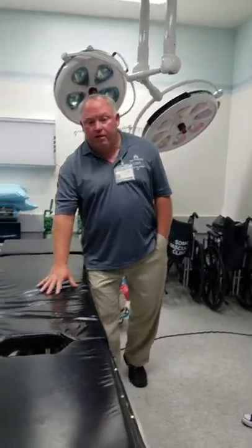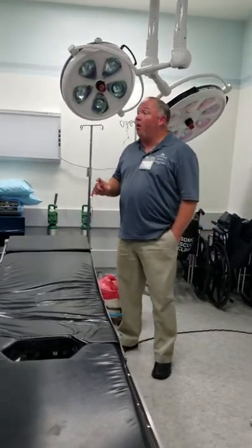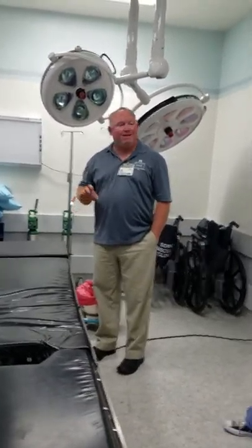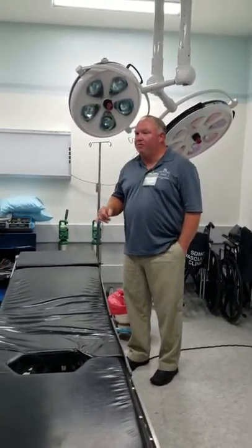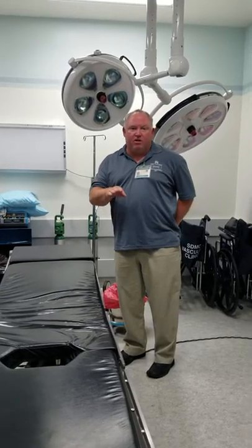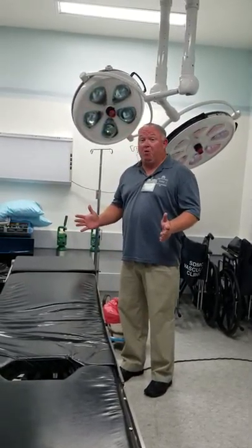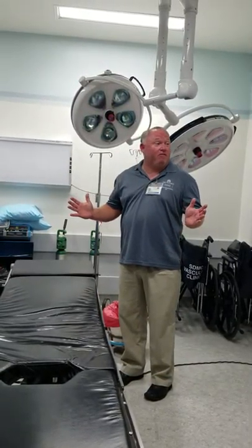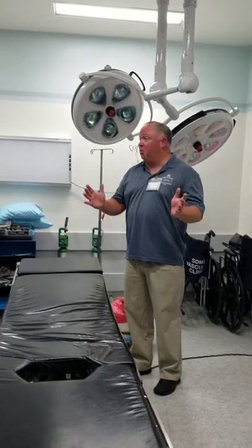The patient will be in the middle of the bed. Some doctors might want a small towel bump — not a big deal — underneath the hip, just to get a little bit up off the bed. That's all you're going to do. Nothing too exciting for an anterior approach — pretty simple.